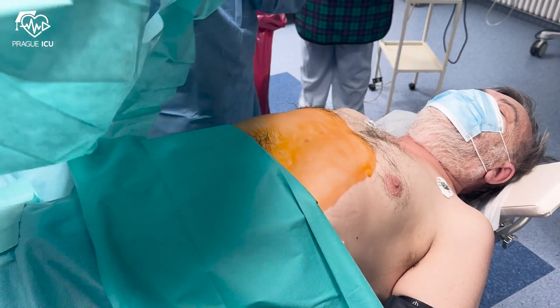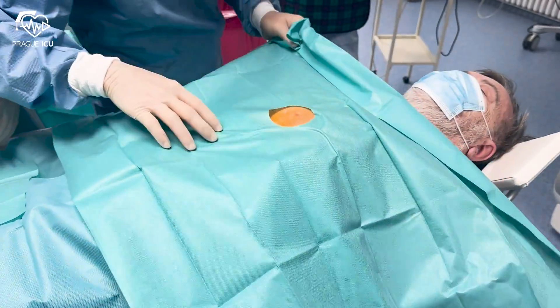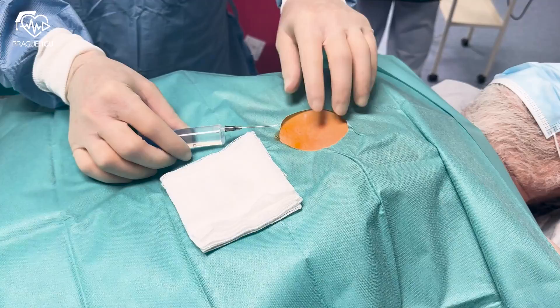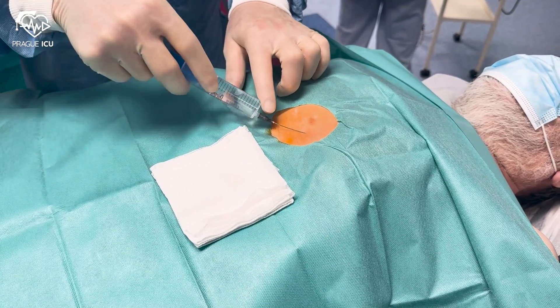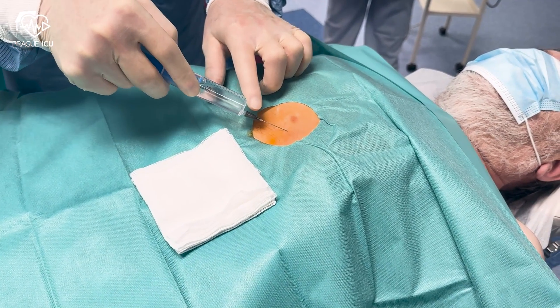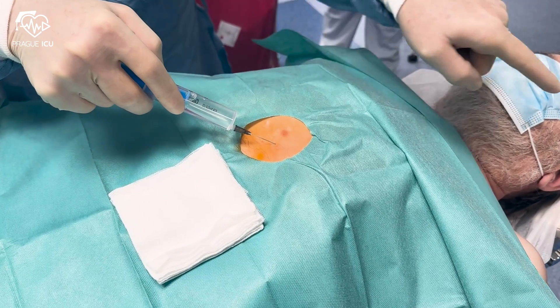Sterile drapes are placed around the site. The superficial skin and the deeper tissues are then locally anesthetized using lignocaine solution.